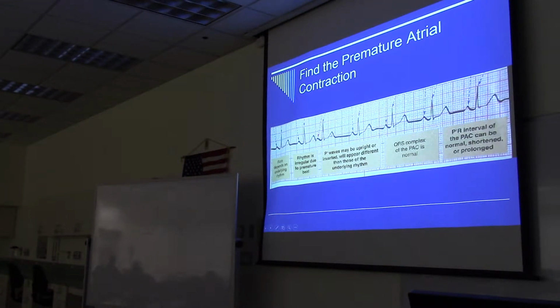And then the last bullet on the previous slide talks about a pause, a compensatory versus non-compensatory pause. So you see a pause in any conduction, and then it starts over as normal. Sometimes you see a pause and sometimes you don't. It's not a big issue.